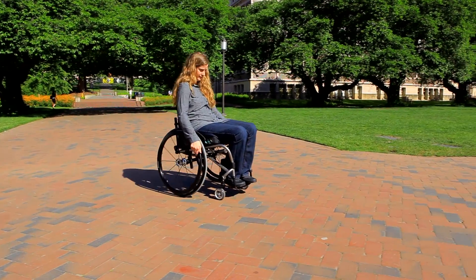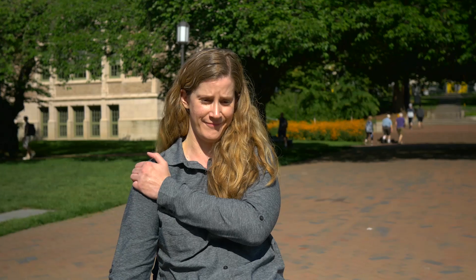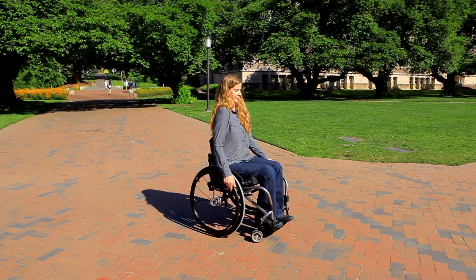Your posture affects your propulsion form, and your wheelchair influences your posture. Sitting with a slouch causes neck and arm pain when wheeling because the joints are in a harmful position. Sitting upright will protect your joints and muscles, but may feel less stable.